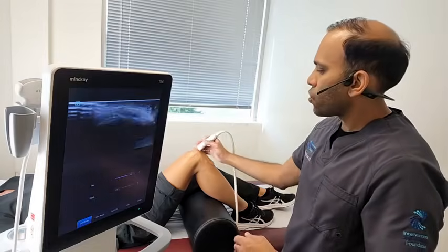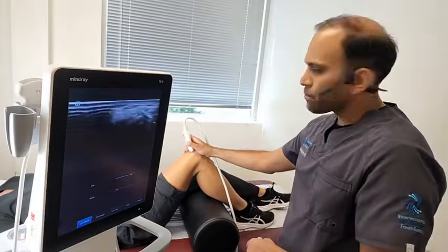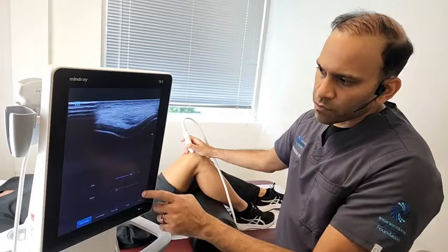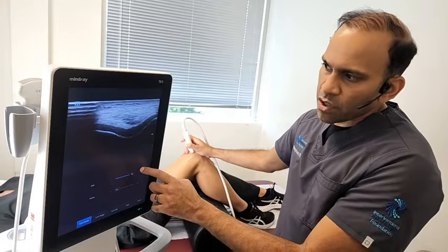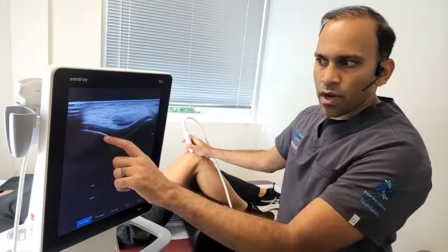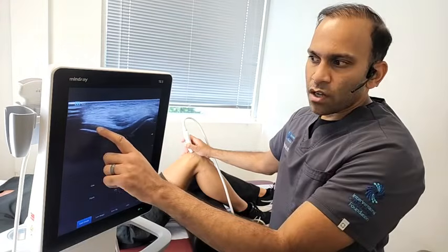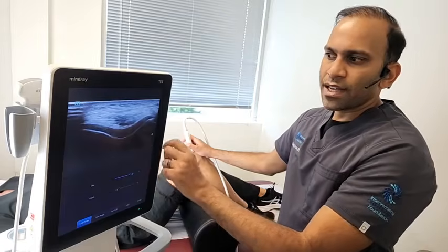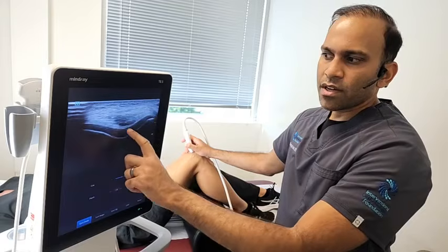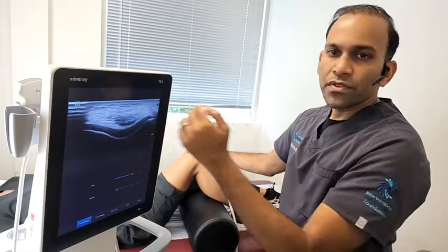Now I go back over the top of the knee, and you can keep your knee flexed like that. From this position here, we now see this kind of U-shaped structure. That U-shaped structure is actually the groove that the kneecap sits in. So this bright white line is a part of the femur, the end of the thigh bone, and this dark line that we see over the white line is beautiful, nice, healthy cartilage. That is what nice, healthy cartilage looks like. And this U shape is the groove that the kneecap sits into.